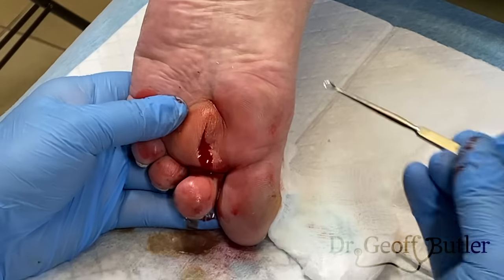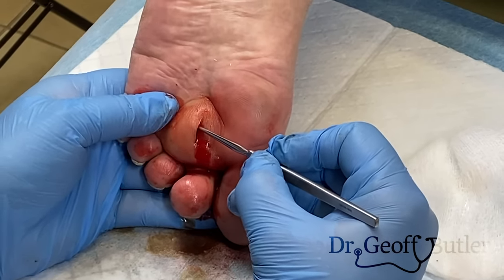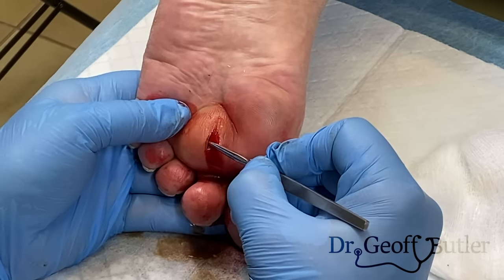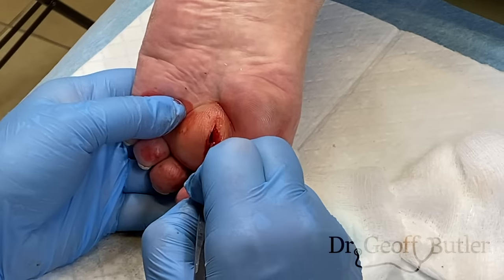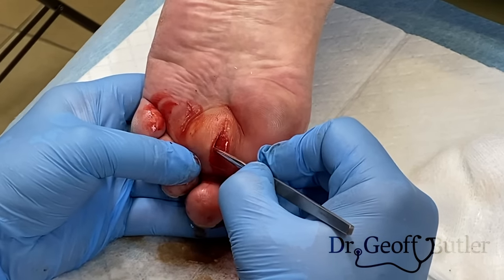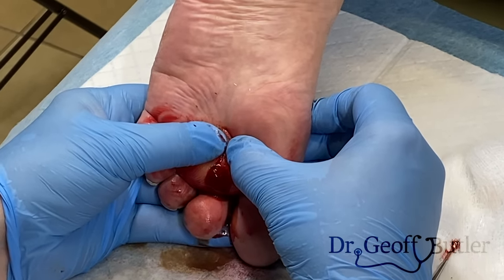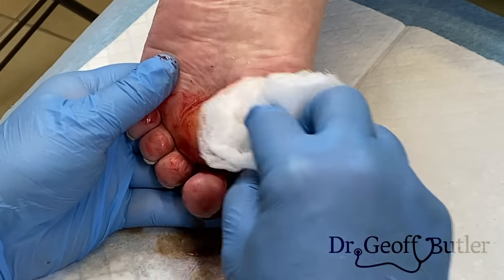I'm going to see if I can use a small kit — it doesn't feel like it's very loculated. Does that hurt when I do that? Not right now, no. So this is a balance between trying to break it down and not be too aggressive. Give a little pressure there — that's usually what will happen after we break down some loculations: we'll get a little bit more drainage through there.